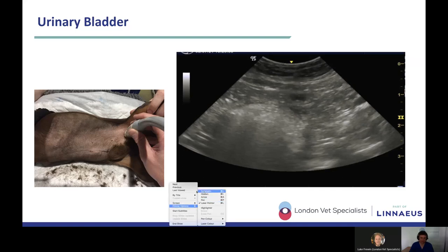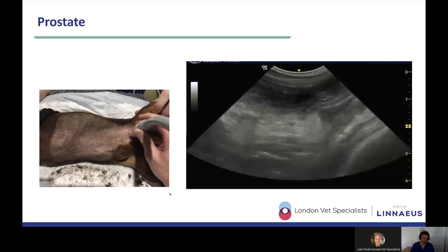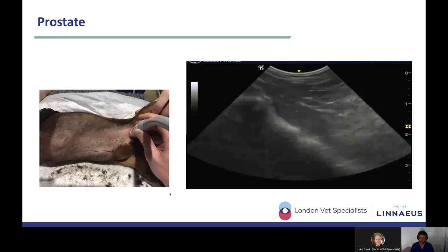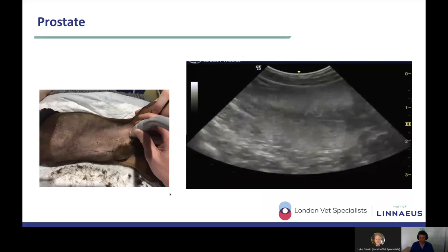So there we go. That is your urinary bladder. That moves us on to prostate. Prostate, very similar sorts of movements to the urinary bladder. The same movements that you're using to examine the trigone, you're using to examine the prostate. Once you place the probe on the caudal mid-abdomen, you can slide the probe caudally, just looking for the trigone. And if you slide it even further caudally, hopefully the prostate should pop up.